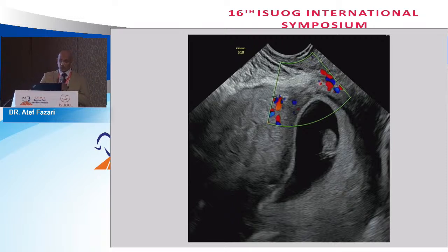So our rule now, as I mentioned this morning, is that whenever you have an early pregnancy, the aim is not only to confirm the pregnancy, intrauterine or extrauterine, ectopic or heterotopic, or the viability, or the number of embryos. I think it is better to concentrate on whether there is a history of scar. If the patient has a history of a previous scar, we need to look: is it a scar pregnancy, and is it exogenic or endogenic? And then we have a very good sign to help us differentiate.